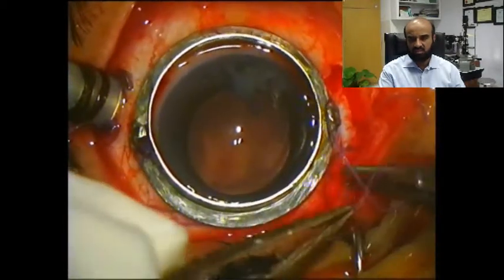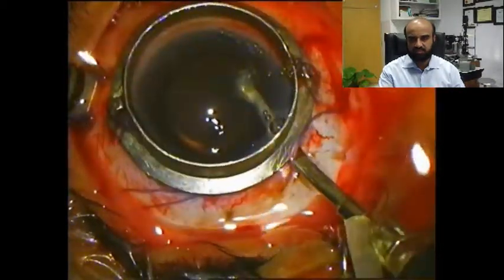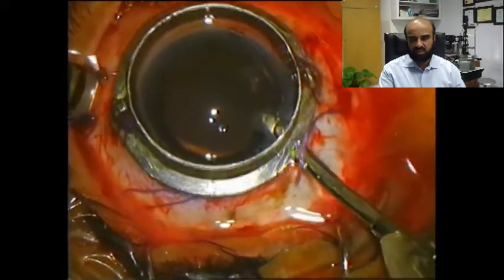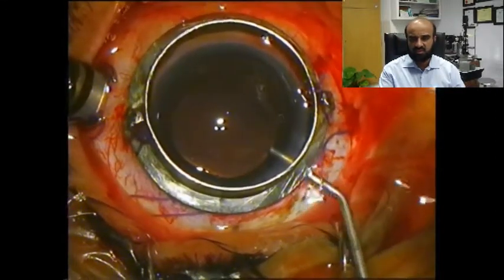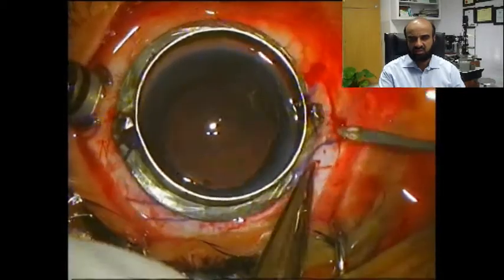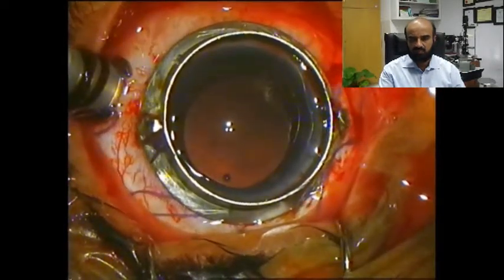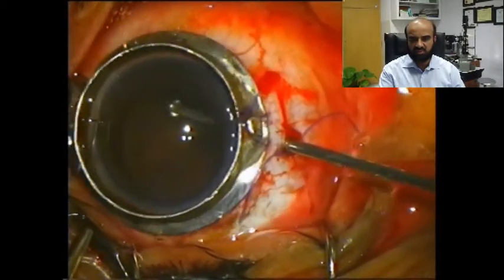The ring is being tied for placement of the contact lens. The anterior chamber is being cleared of the remnants of lens matter with the help of a Simcoe irrigation cannula, and then viscoelastic is injected into the anterior chamber. We then proceed with the vitrectomy under the microscope for the anterior part of the vitreous.